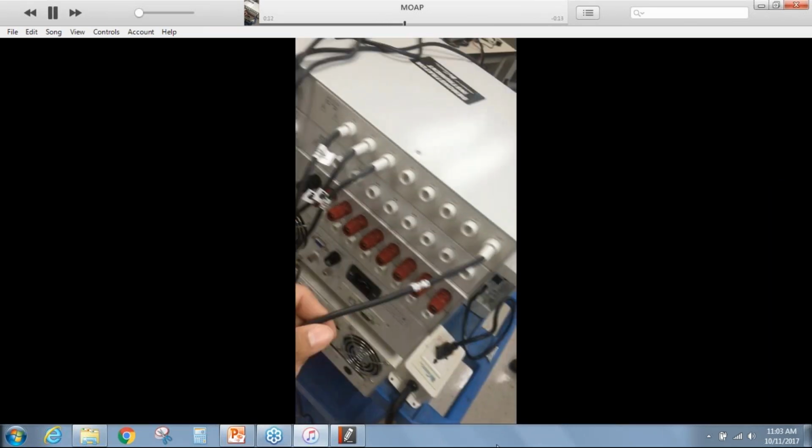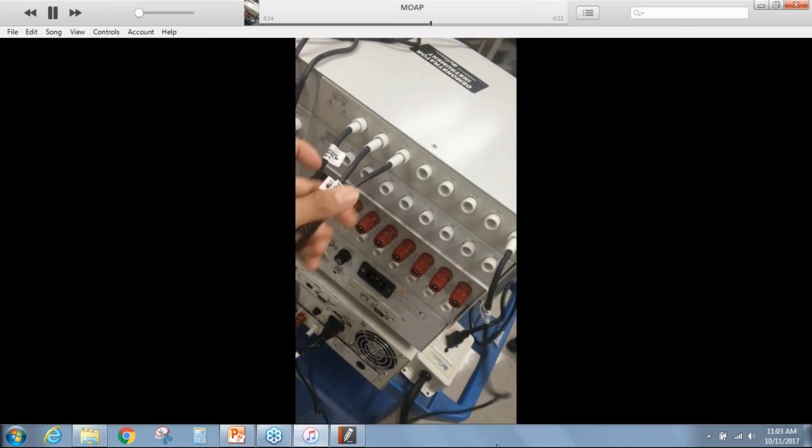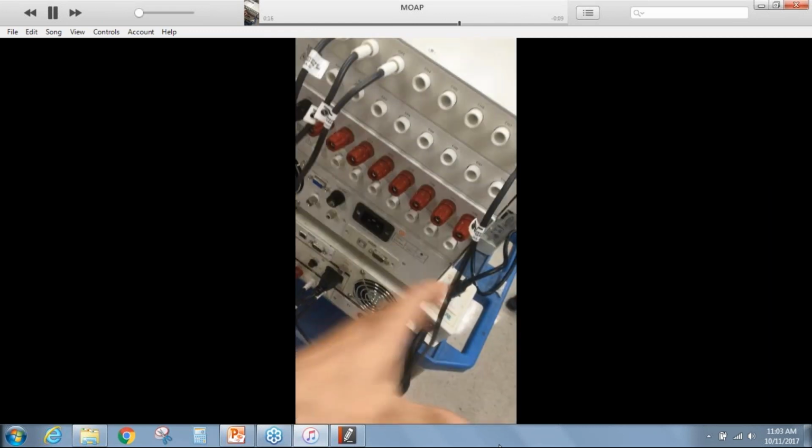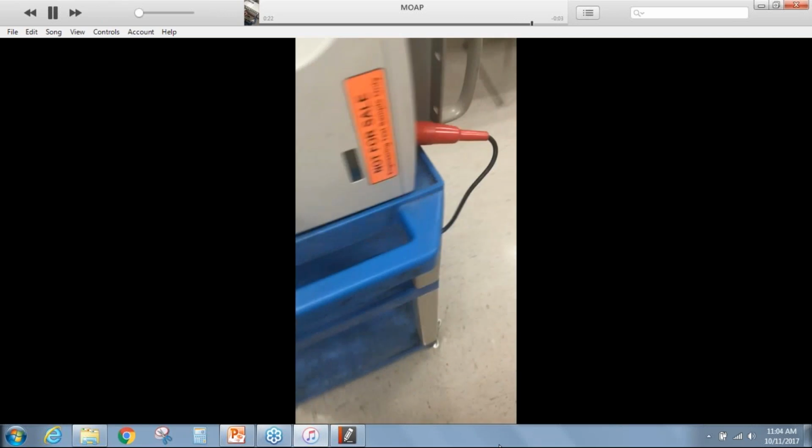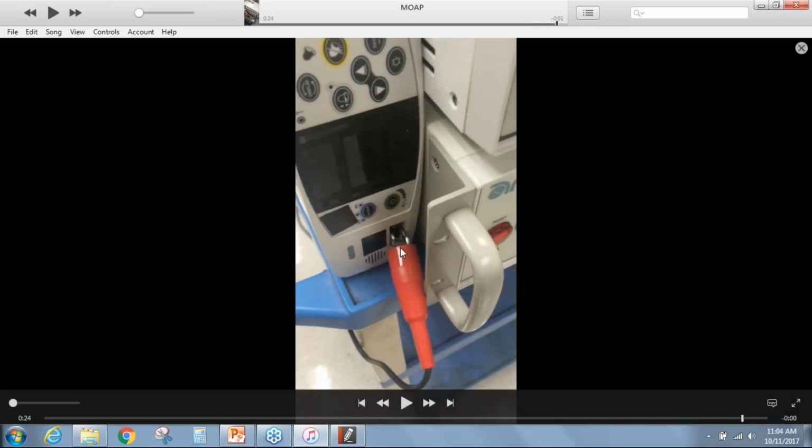And so this is the connection. Again, this is showing you how T2 is connected back to our instrument that's going to measure, that has the MD in there, and the MD is connected to an applied part on a medical device.